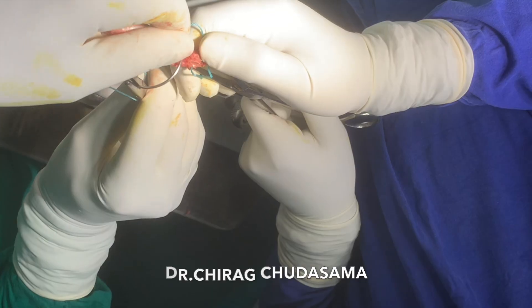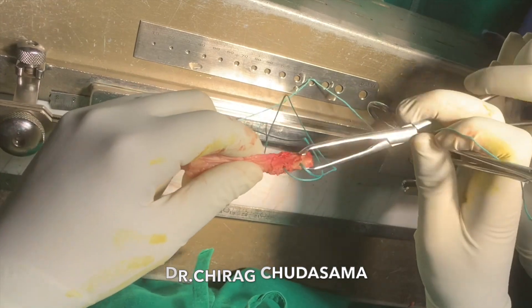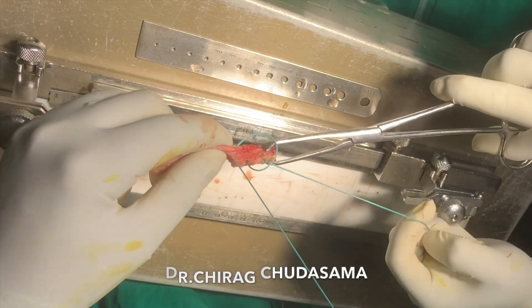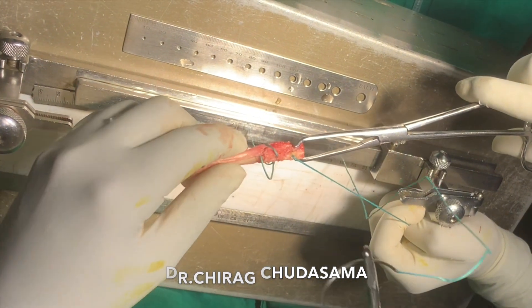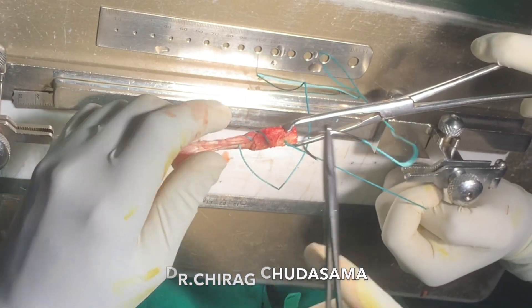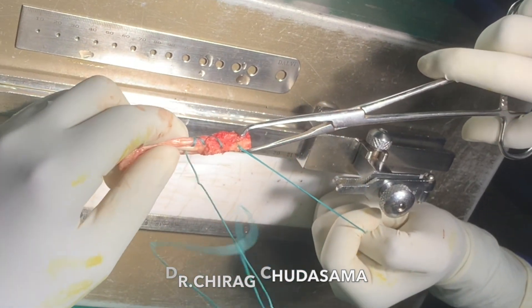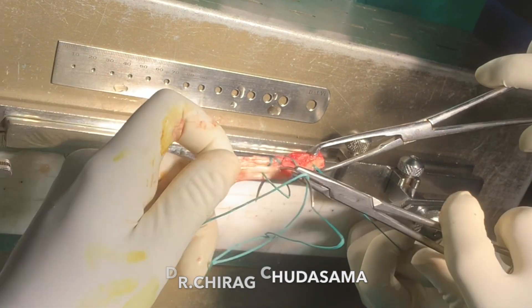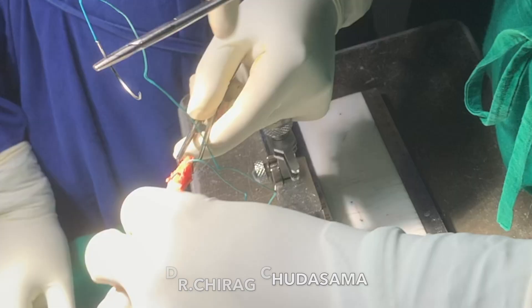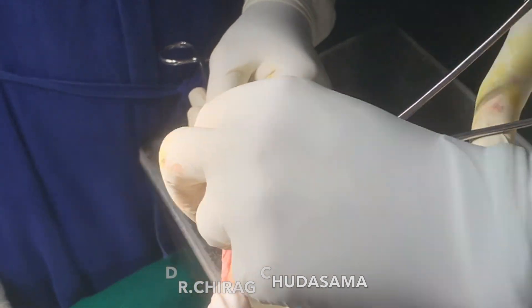This is the tibial tuberosity side that will go towards the tibia. You just need to pass through both the holes, and then prepare it through the tendon — just like whip stitches in soft tissue grafts with semitendinosus. This preparation is important because sometimes the graft protrudes out in ACL reconstruction due to excessive graft length, and you may need to cut the extra protruding part or nibble out the protruding bony plug from the tibial mouth. That will not compromise your graft fixation, and you can even have a backup fixation on the tibial side if required.